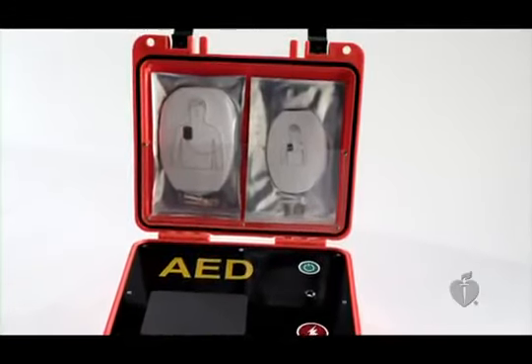The important thing is to be familiar with the AED you will be using, if possible, before you actually need to use it. When you are using an AED, remember to turn it on first and follow the prompts as it leads you through the rest of the steps. For infants, a manual defibrillator is preferred to an AED for defibrillation. If a manual defibrillator is not available, an AED equipped with a pediatric dose attenuator is preferred. If neither is available, you may use an AED without a pediatric dose attenuator.